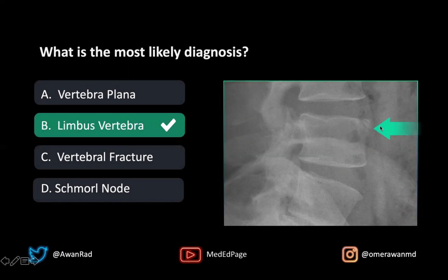This is not a fracture because this fragment is very well-corticated. It's certainly not an acute fracture. An acute fracture will result in ill-defined margins, whereas these are well-corticated margins. There may also be prevertebral or paravertebral soft tissue swelling with a fracture, which we don't see in this case.